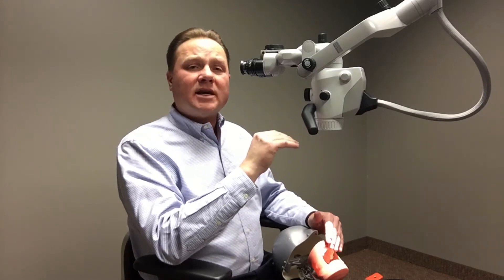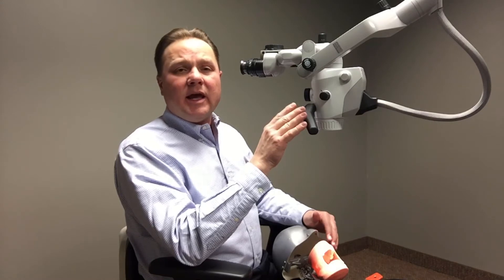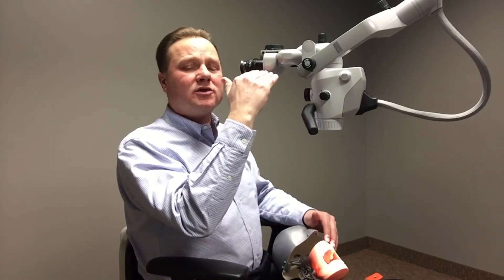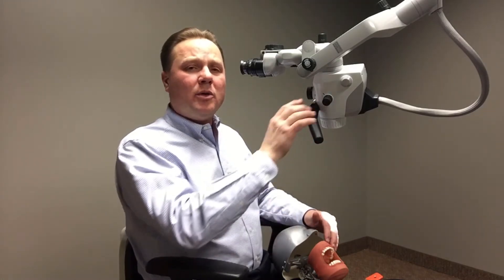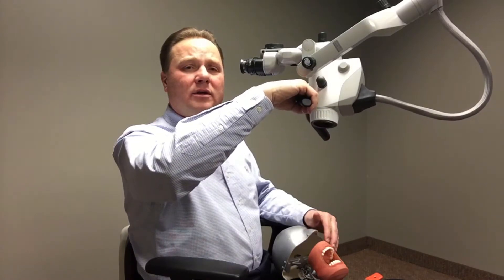The second benefit that this microscope can provide is our Mora. What Mora does is it gives the ability to have the binoculars remain parallel to the ground. But I can take the binocular head and swing or maneuver it up to a 30 degree angle.